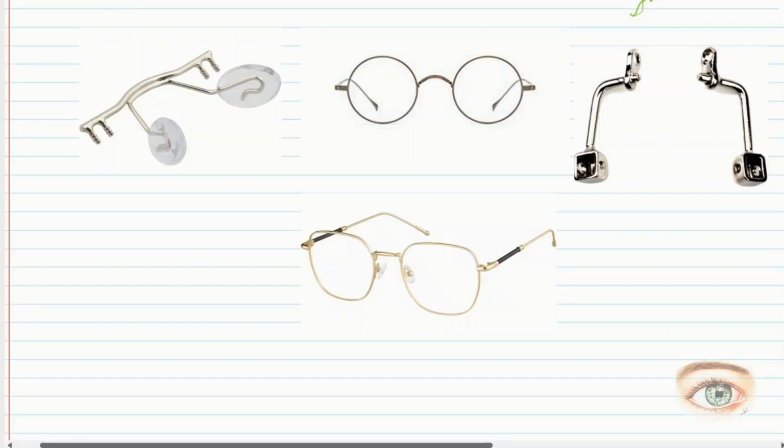So these are a few pictures of metal nose bridges. This is a typical picture of a metal saddle nose bridge. As you can see, there are no nose pads right here, and we just have this metal saddle nose bridge.